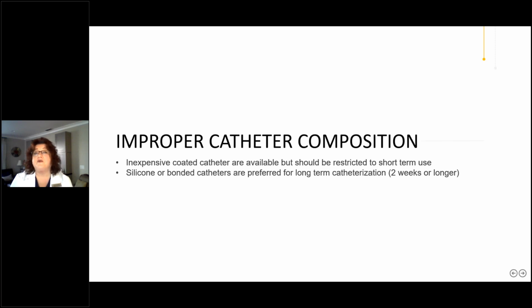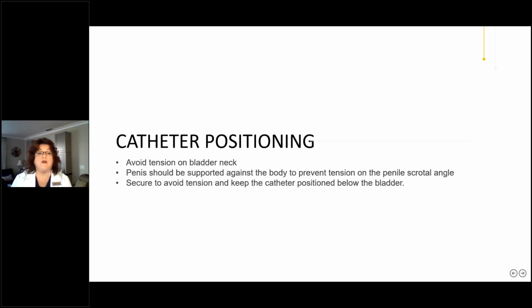They are preferred for 2 weeks or longer because they are so helpful. The positioning, again, avoid tension on that bladder neck. The penis should be supported against the body to prevent tension on the penile scrotal angle.